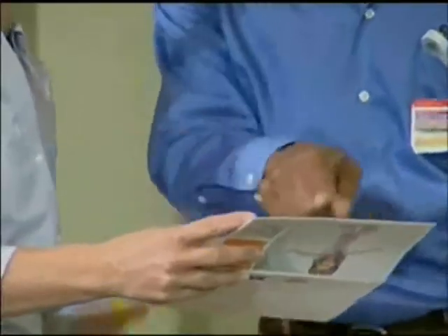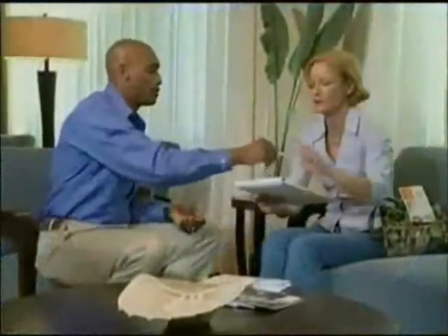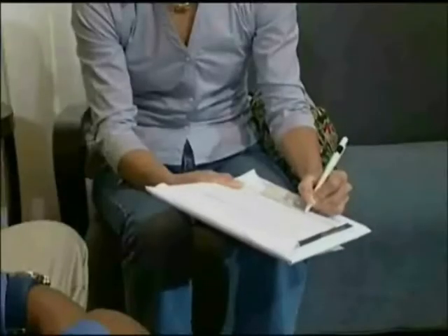On the day of your examination, you will first have to sign the patient information record and undergo pre-examination screening. At that time, you may be asked some questions to make sure that you are eligible to undergo the MRI examination.